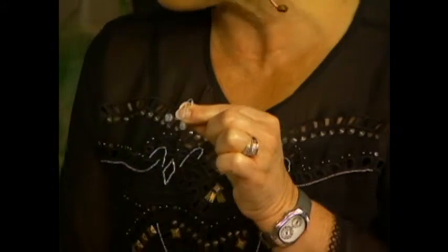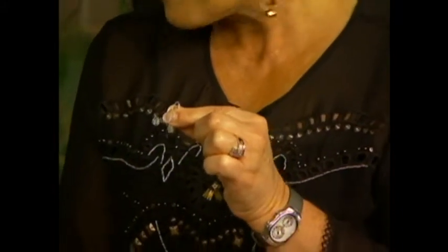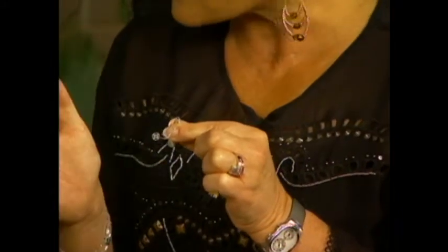That's great. And battery life is changing for these things? Yeah, battery life is about 2 weeks. So, I mean, when you think that's such a minor little thing to be able to give you back your hearing. Right.